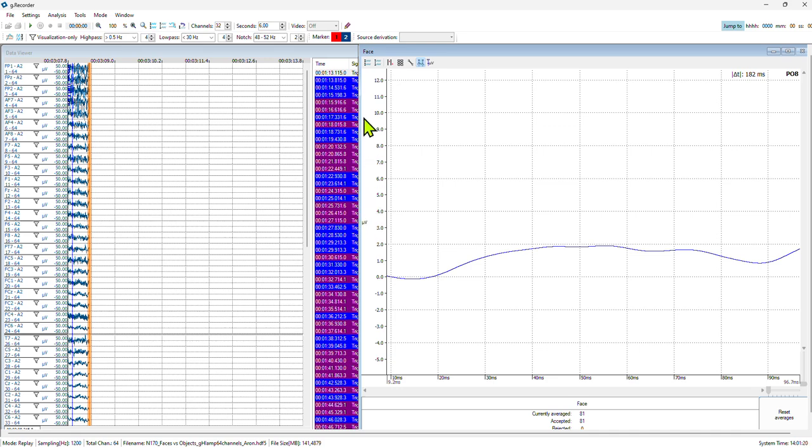You come with a pointer to the y-axis where the values of amplitude are shown, and then you press the right mouse button and you drag it down, and that will raise the amplitude, or up, which will actually diminish it, which is a kind of counter-sense, but you try either way and you will find it out.